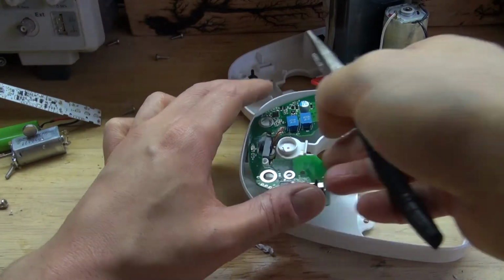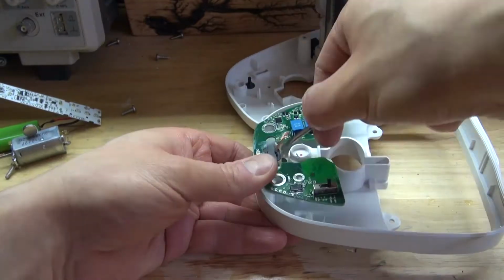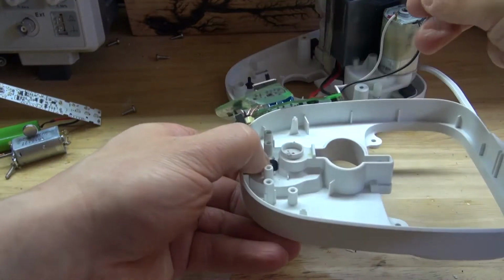And now let's go ahead and remove the circuit. Carefully remove that transformer without damaging it. And there, it comes out just like this. This part of the housing is now useless.